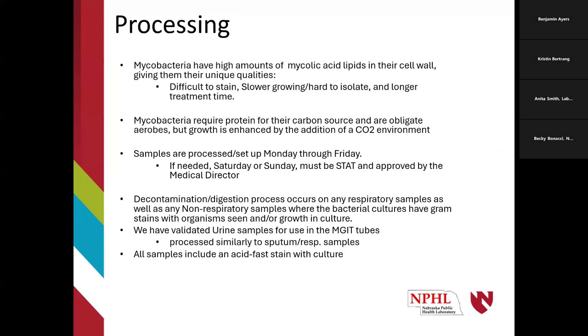Mycobacteria have some unique qualities. Because of the high lipid content, the mycolic lipid layer in their cell wall, they are very difficult to stain. They're very slow growing, so we typically will incubate these up to 6 weeks and maybe longer. The treatment time is longer. And again, going back to the swabs, mycobacteria, because of their lipids, will stick to those swabs. They're very hydrophobic, and so that makes isolation more difficult.